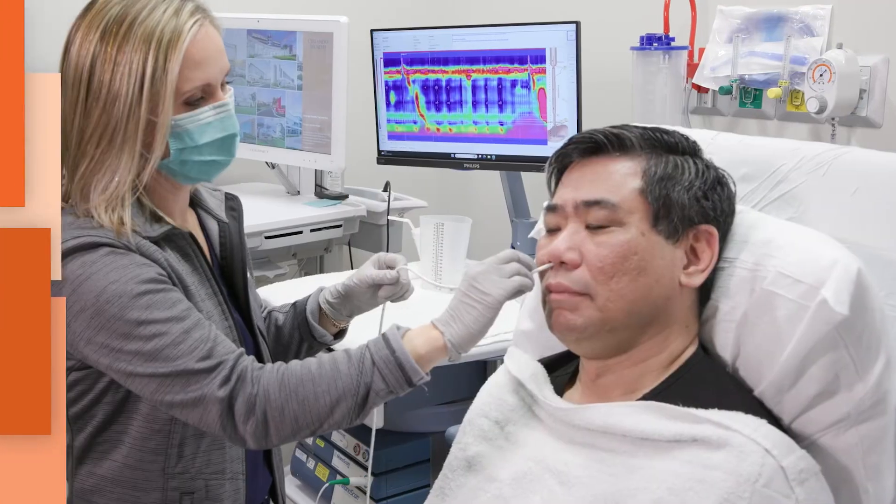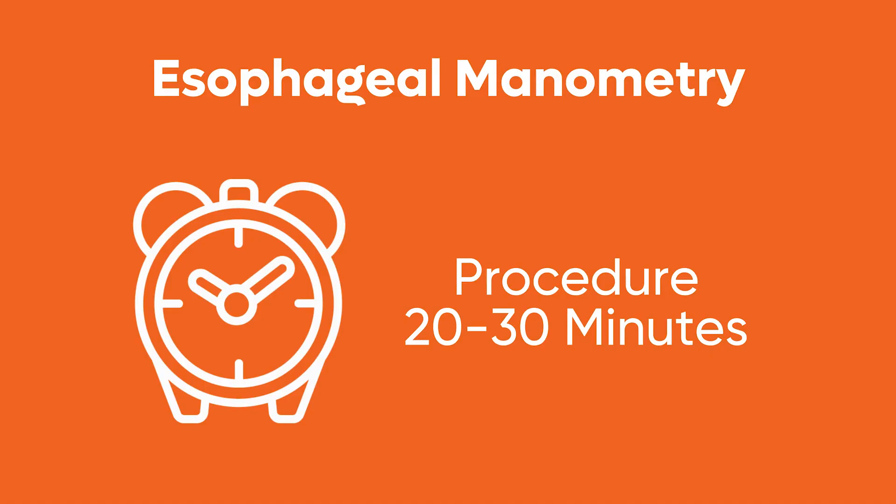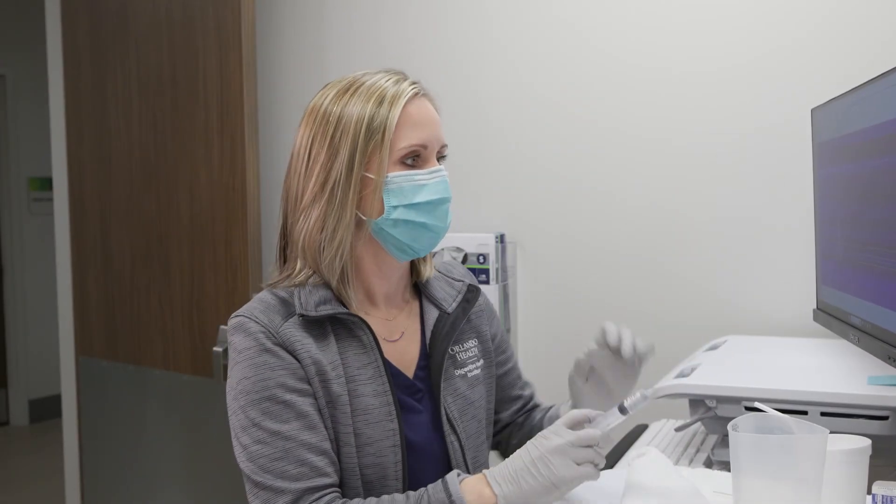The catheter is then gently removed after 10 to 15 swallows and additional maneuvers. The entire procedure usually takes about 20 to 30 minutes, and the physician reviews the esophageal manometry results.